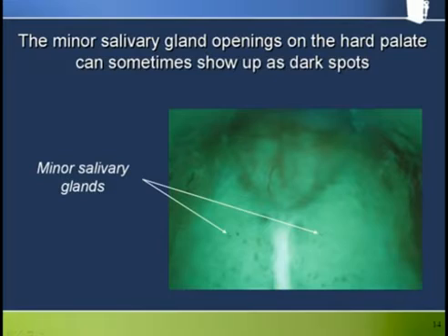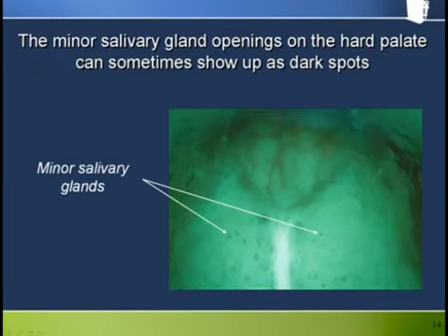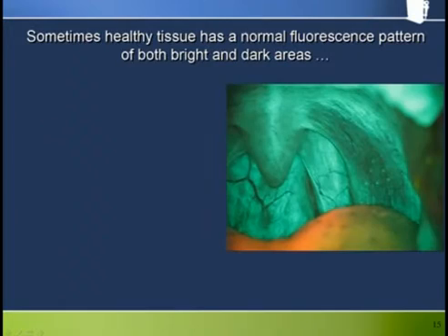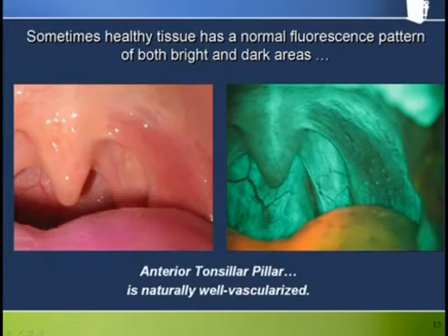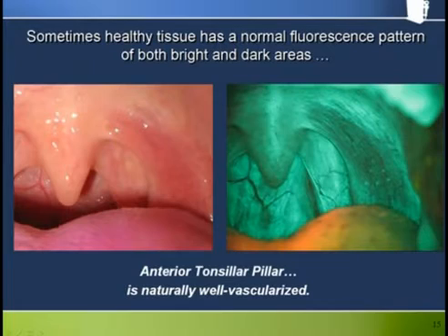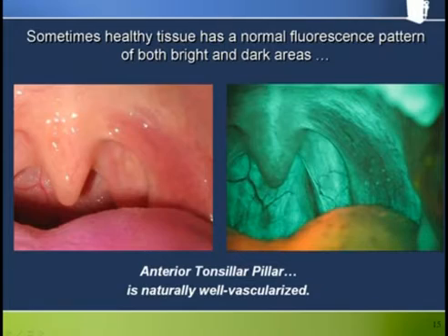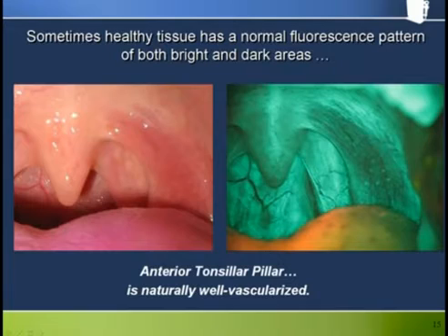The minor salivary gland openings on the hard palate can sometimes appear as dark spots when using Velscope. The anterior tonsillar pillars can be particularly well vascularized and therefore can appear quite dark with fluorescence. Notice how the reddened areas under white light correspond to the darkened areas through the Velscope.